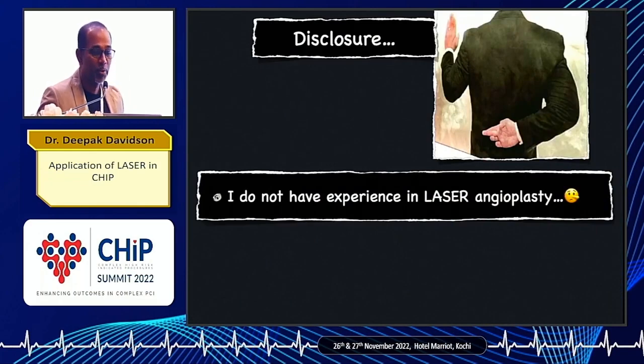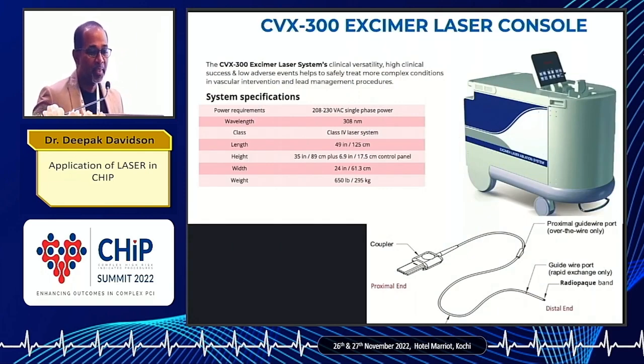Well, that's my disclosure. I do not have any experience in laser angioplasty. However, I shall share with you a few of the cases that were shared with me by my friends for this presentation. I shall take you through, over the next 5 to 6 minutes, the usefulness of laser in coronary interventions. Well, that's how the laser console would look like.